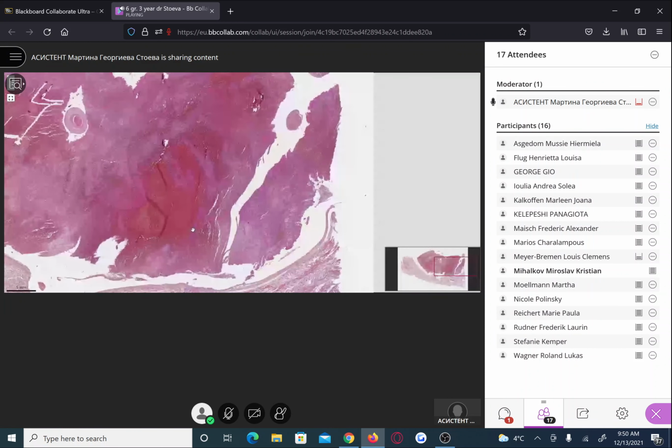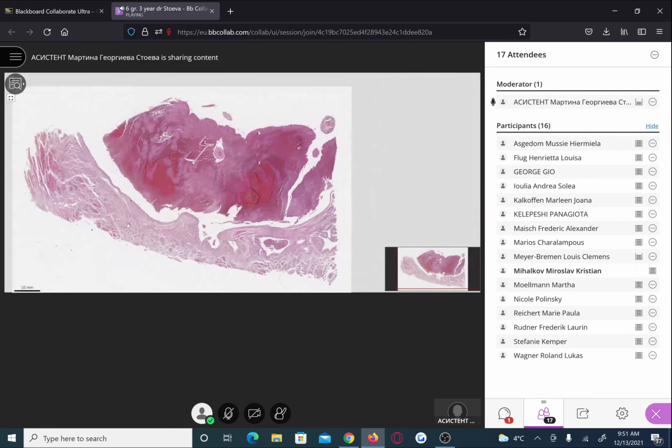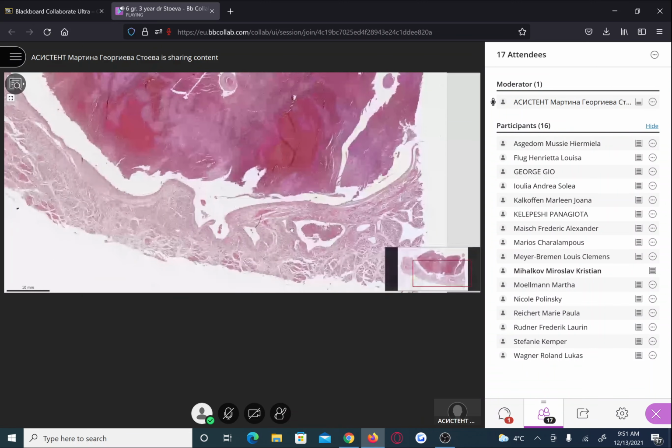So finally we can make the diagnosis, a thrombus in the heart. The name of the slide is written only as mixed thrombus, because in the past it was written that it's in an atrium. Honestly, here, just based on the slide, we can't say exactly which part of the heart this is, but at least the cardiomyocytes are well visible.